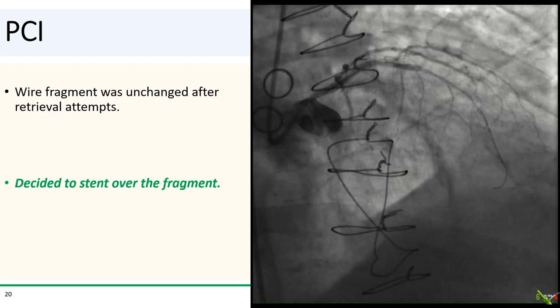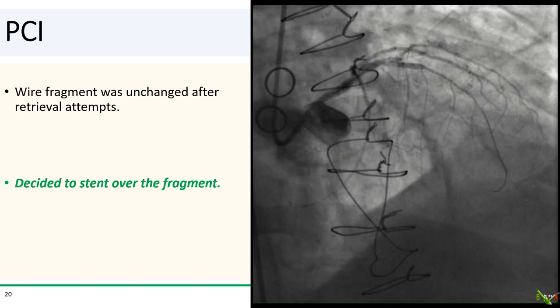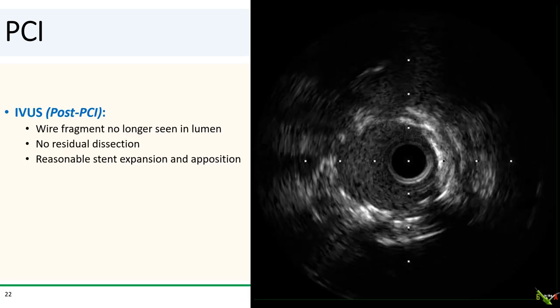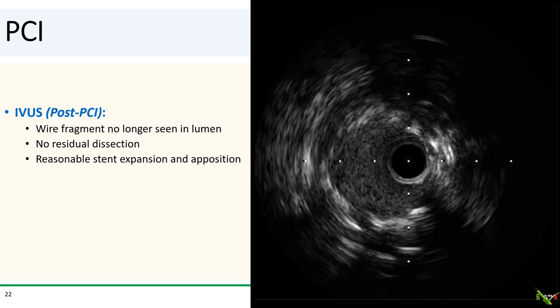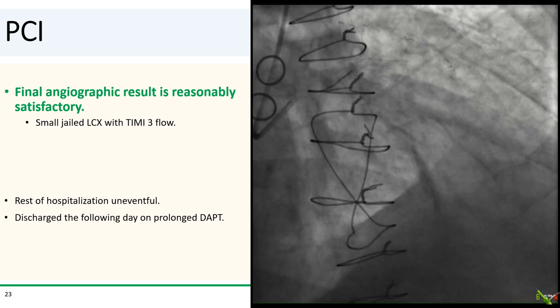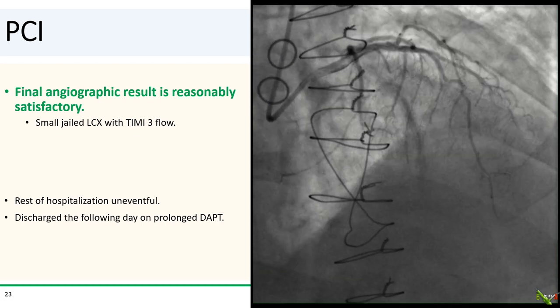After our attempts at retrieval, the wire fragment stayed fairly unchanged. At this point, we decided to just stent over the wire fragment. We deployed a 3.5 by 33 mm DES from the left main into the LAD, jailing the circumflex. The stent was then post-dilated with a 4.0 mm NC balloon. After stenting, we did repeat IVUS — the wire fragment is now trapped behind the stent and is no longer free in the lumen. There was no dissection, and there was good stent expansion and strut apposition. Here is the final angiographic result, which we thought was reasonably satisfactory. The patient had an uneventful overnight stay and went home the next day. We did recommend prolonged dual antiplatelet therapy.